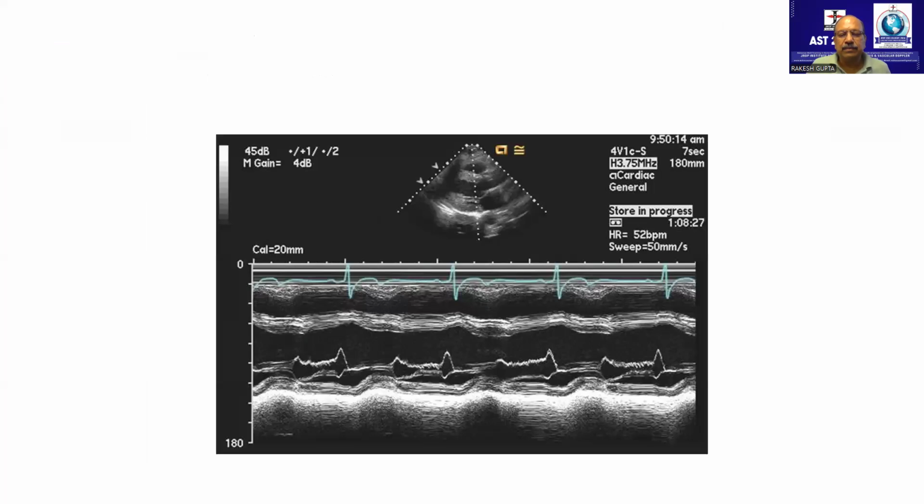Can you see this now? This is M mode across the mitral valve level. So this is diastole, this is E wave, this is A wave, correct? During diastole, the mitral valve opens and if an AR jet is present, the AR jet will strike across the mitral valve. So it produces a sawtooth kind of appearance. Look, this is sawtooth. Sawtooth in Hindi is आरी.